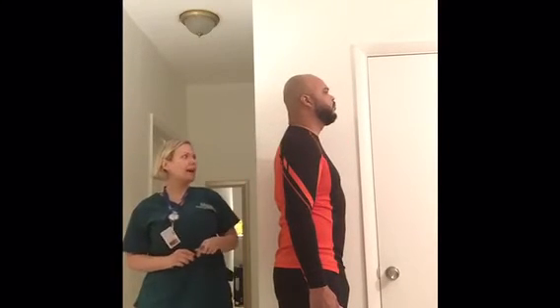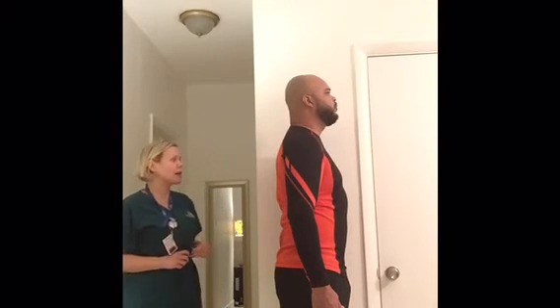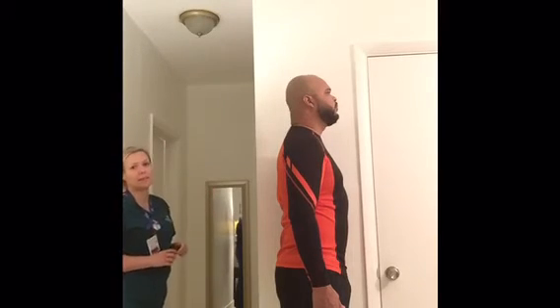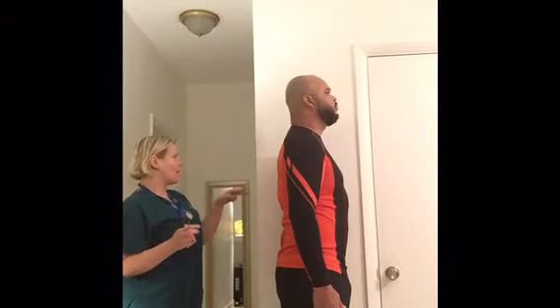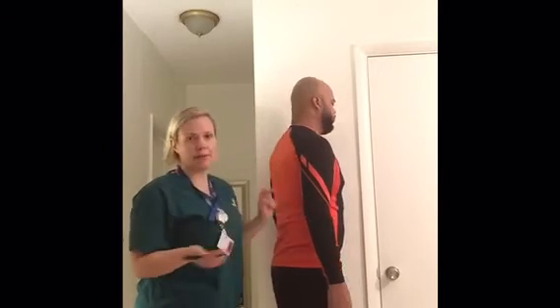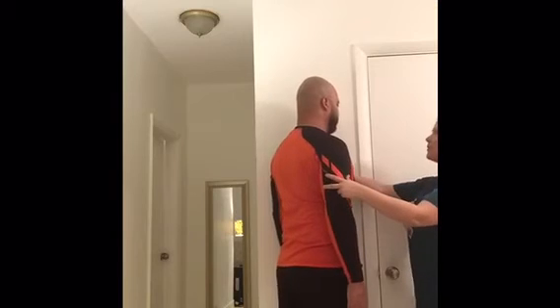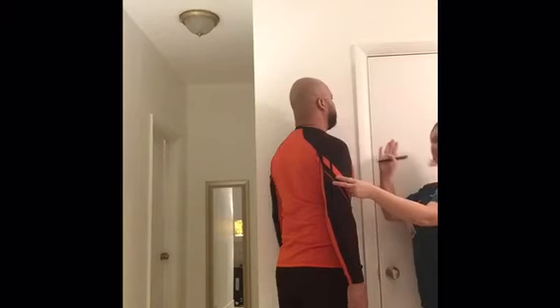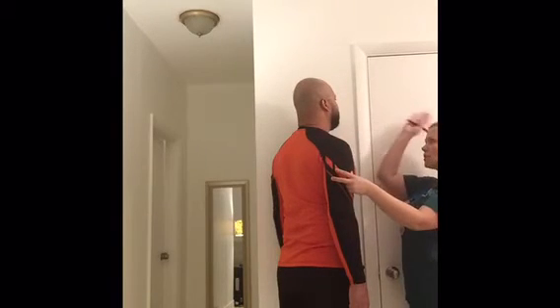Then I will do the obliques. The oblique is used for the intervertebral foramina and the pedicles. When I ask the patient to rotate 45 degrees towards the wall, I'm not going to say that the patient rotates 45 degrees, but I will just move it forward this way. And I want to ask the patient, if able, to move their neck to look towards me or towards the window.